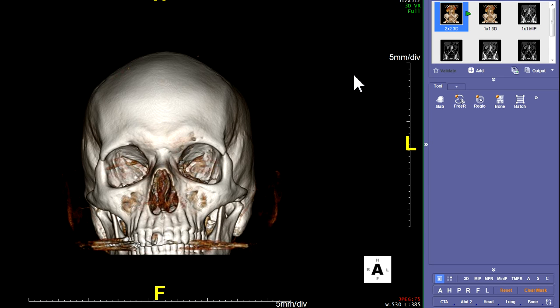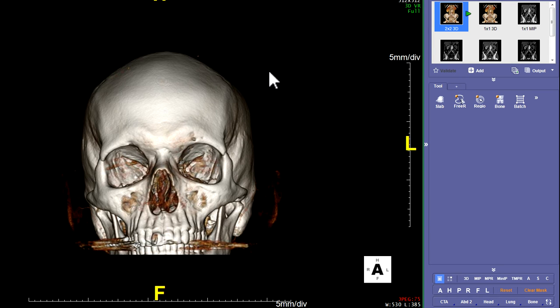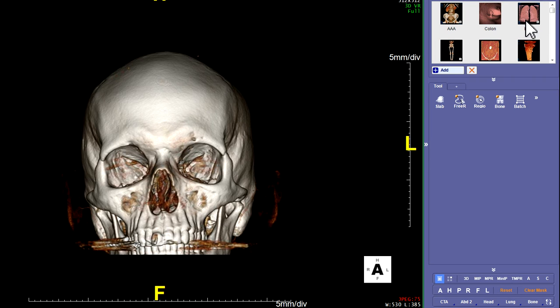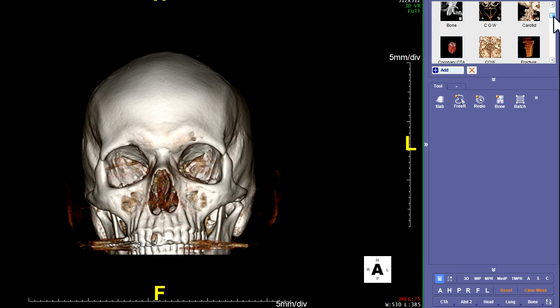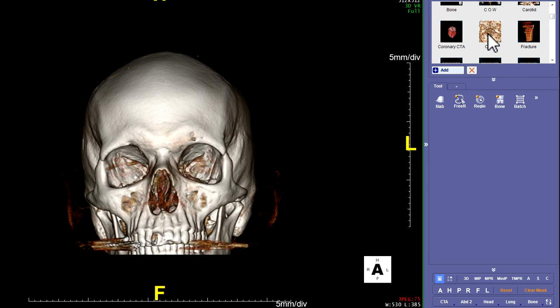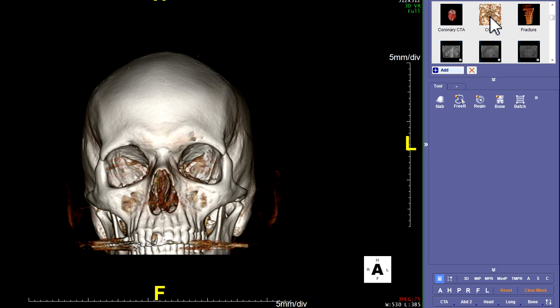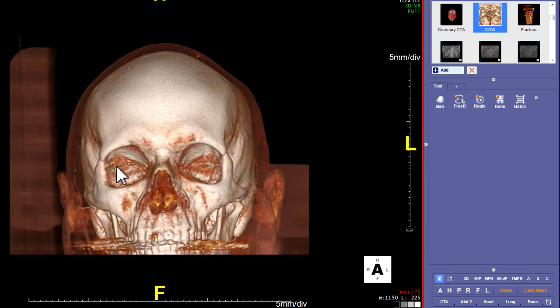The first thing you do is go to the patient list and double click the one that has a bunch of pictures — the thin cuts. It opens up into four-on-one and then you open it up into a one-on-one using the 3D. Then you have to set the window to show the cartilage. Go to under Viewer, then under Template, scroll down until you see the COW. Pick the COW that's on white — not the one with a black background. Double click that and it'll show you all the cartilage and stuff you need.